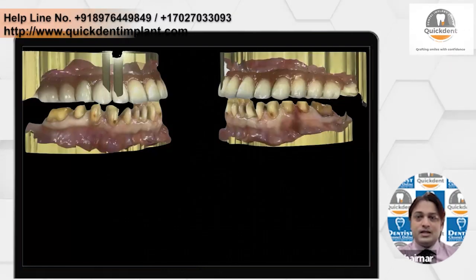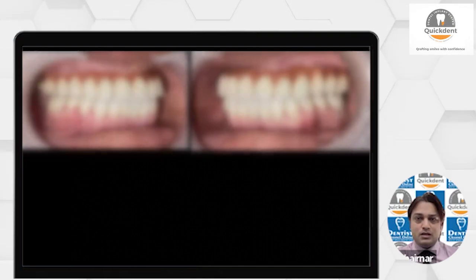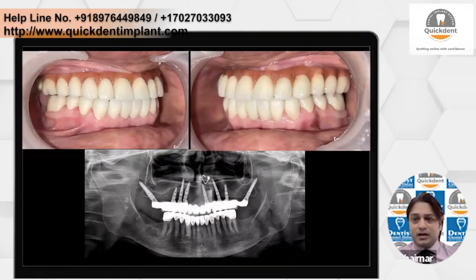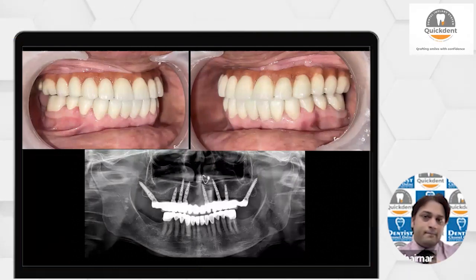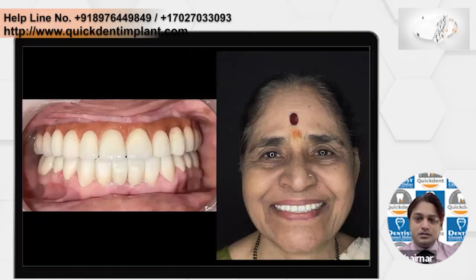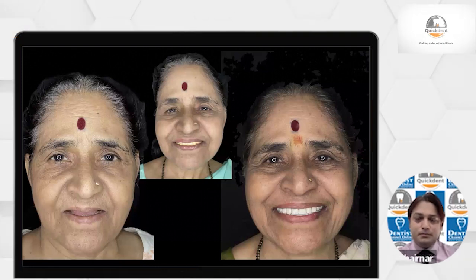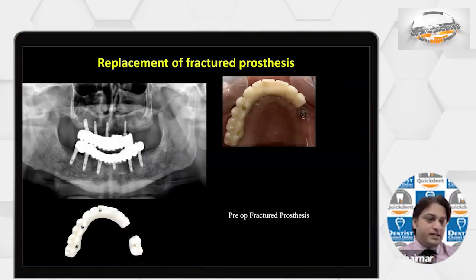Now lower, we decided to go ahead with the individual crowns and bridges. I think no root canal was done, but then we adjusted the plane of occlusion and every single crown was given. So it is basically an FMR case. This is done, and here this is the final of the patient, before and after. So you can see her lip was getting dropped in the pre-op, but after, finally she got a very good lip support also. So that was one more case.